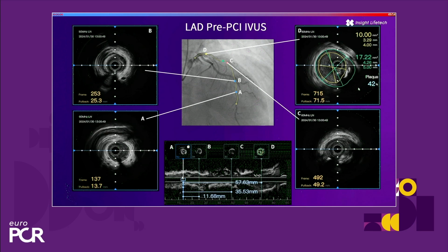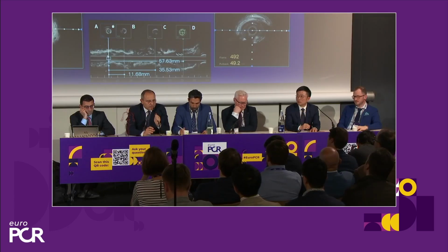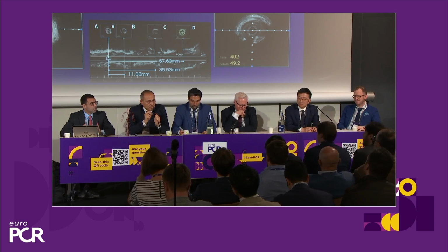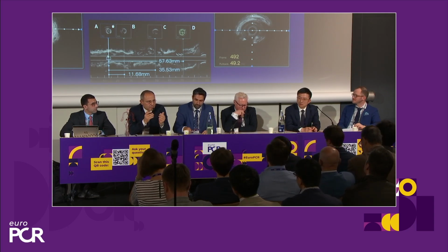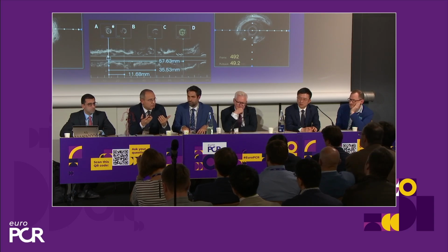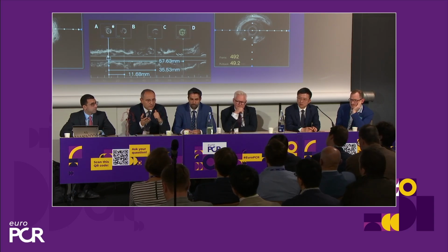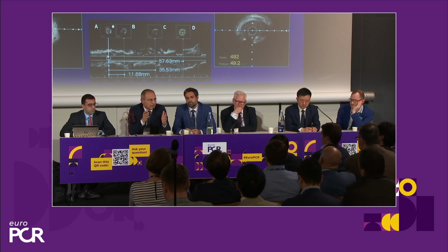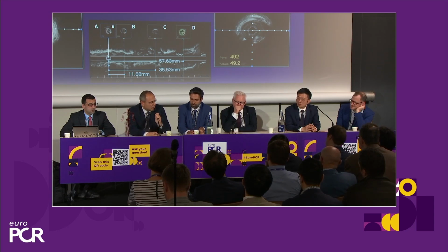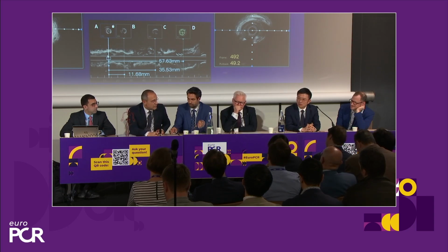So before we see the conclusion of the case, there is one important question that we need to address from our colleagues: diffuse disease, focal disease, sequential stenosis, and the difference between physiologic assessment and intravascular imaging. That is why I was waiting to show imaging before addressing this question, because IVUS shows you where disease starts, where disease ends, more or less, from normal to normal. Physiology tells you something similar, but it is different. It's a different concept. There might be a crosstalk between disease and lesions. Who wants to take this one?